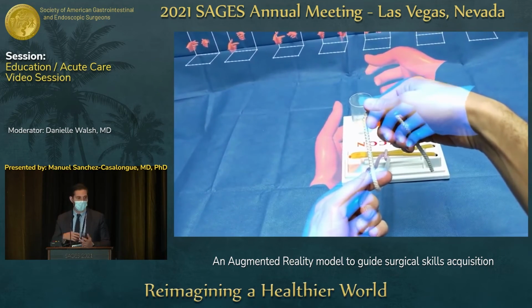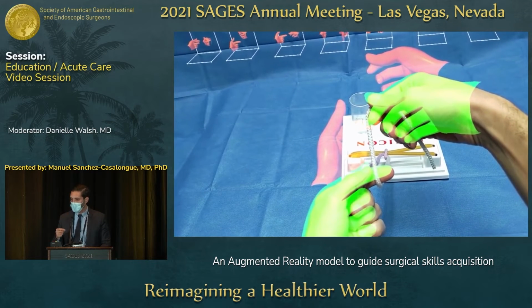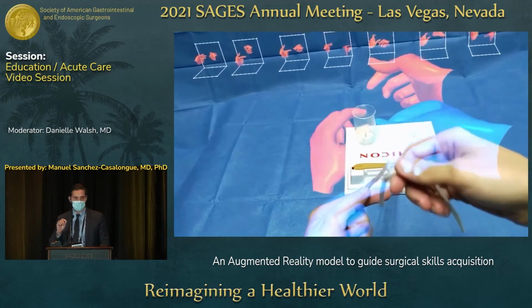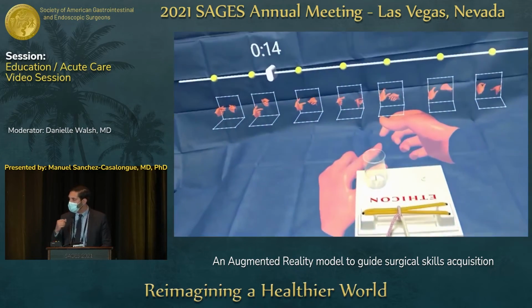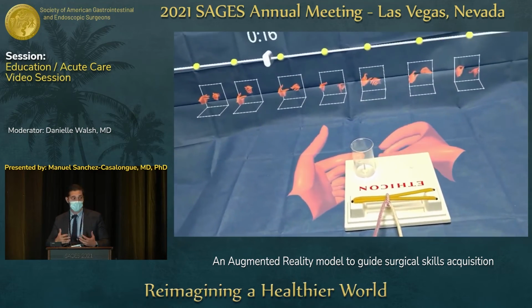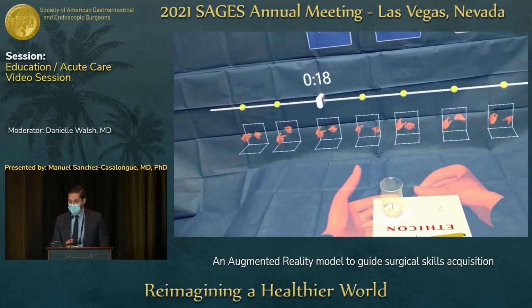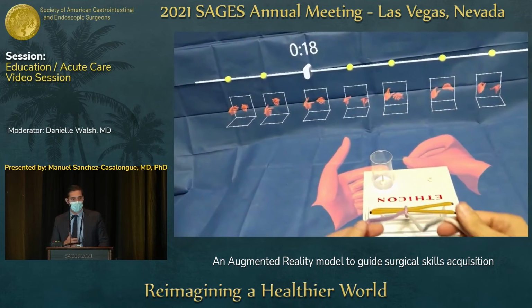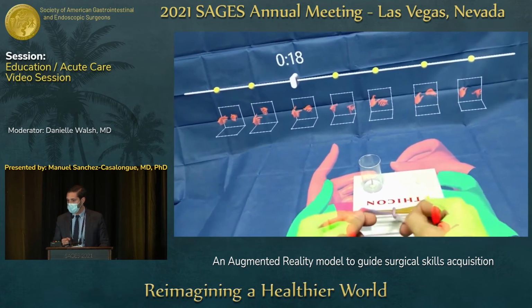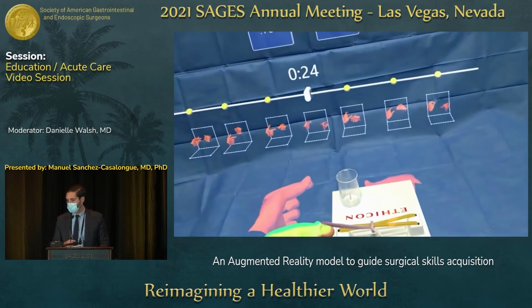So they move their hands, they follow the teacher, they get to the next marker, and we see again green, red, and when they hold the position for a second, a flash of white, the student hears a ding sound, and then they know that they can proceed with the next set of motions. So again, this really allows the student to stop at each of those key moments. And again, we make it here to the marker, and we can use voice commands. So we can say next. And so, for example, we'll go from 18 to 24 seconds. And the student can say next if they think it's the next motion that they need.